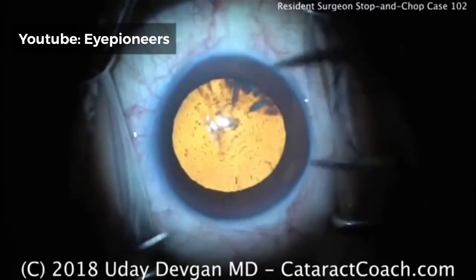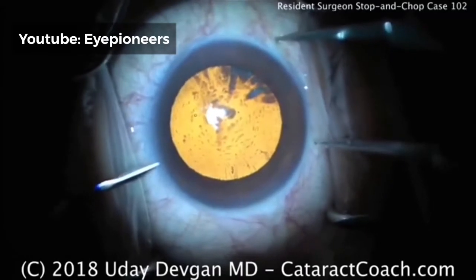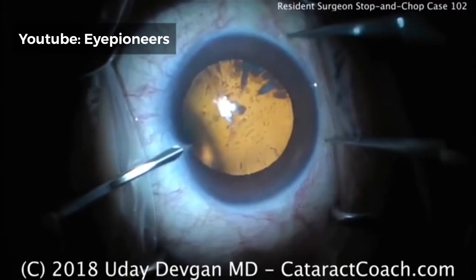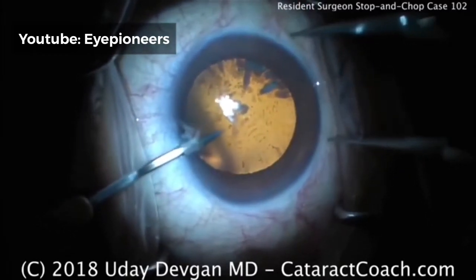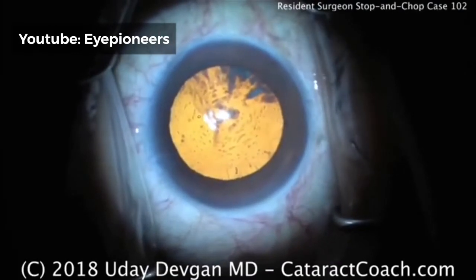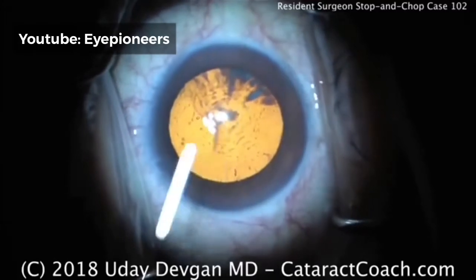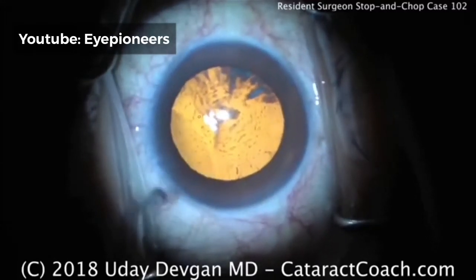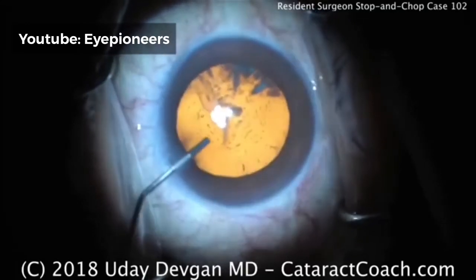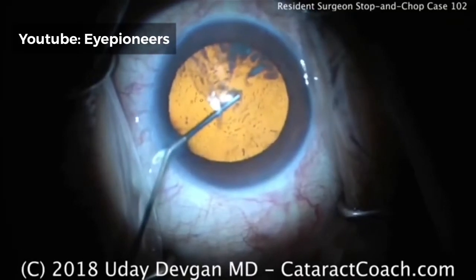This is cataractcoach.com and we're watching a resident surgery. This is August of the senior year for residency here in the U.S. This surgeon has done about 30 cases so far as a primary surgeon. There's the paracentesis being made. This surgeon is particularly talented — this is actually going to be a beautiful case. We have about 16 minutes total, which for August or the beginning of the senior year is quite good.